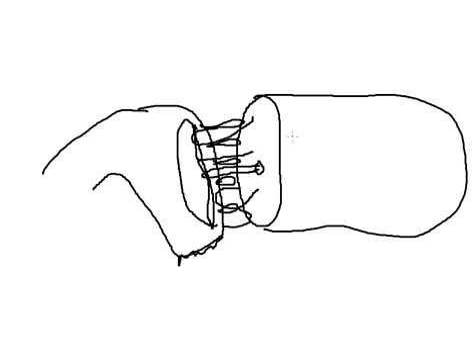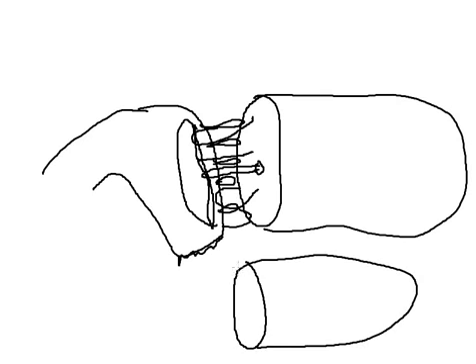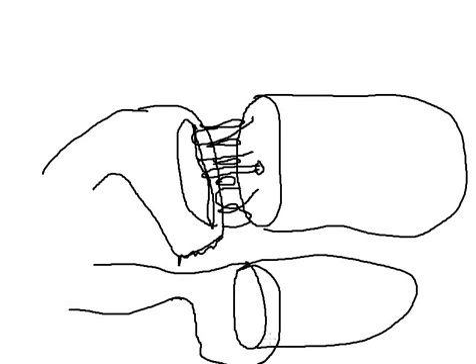It's a two-layer technique where the first layer is the seromuscular to capsule, and then the second layer is actually just deeper bites of the gland. And then when you get to the duct, you take a suture here, and so forth, and then you continue this anteriorly. So when you're done, it actually looks like it's rolled over or invaginated in a 360 fashion.